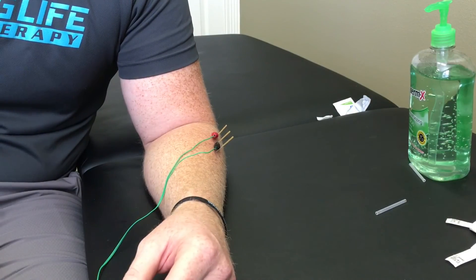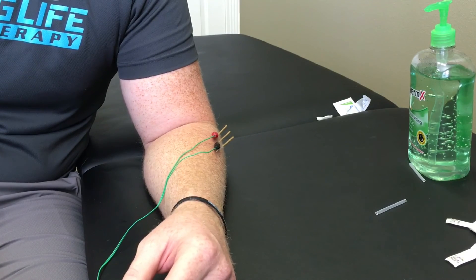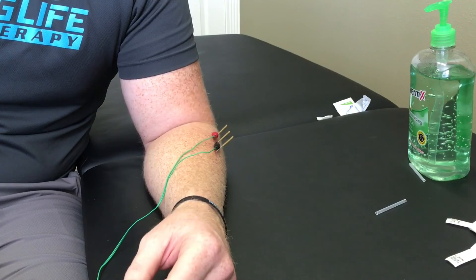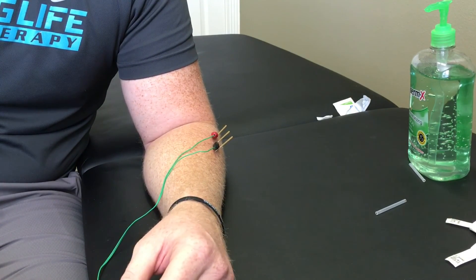I normally don't do this on my patients, but you can use different frequencies that have different reactions with the muscles. So if I increase the frequency of my pulse, you can see as it speeds up — it will then activate the supinator muscle, causing that to turn outwards.